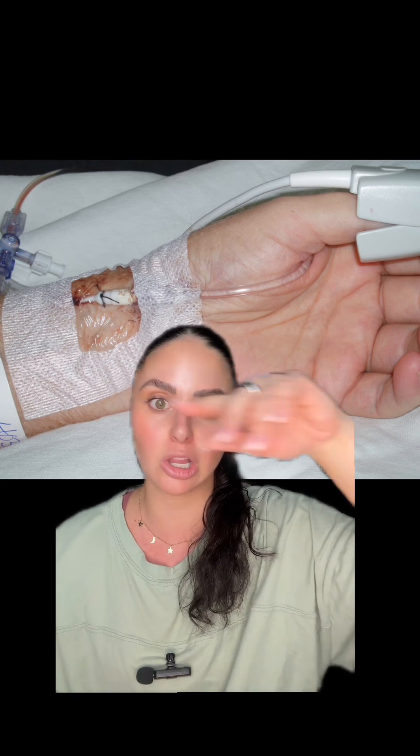If positioning isn't helping, perform a fast flush to see if there's anything blocking inside the arterial line catheter. Also check for good blood return by pulling back on your VAMP, or if you have a closed system, take the little cap off, clean it, hook up a syringe, and draw back. Caution: if you're meeting a lot of resistance, don't force it. Never force a flush, never force drawing back blood.